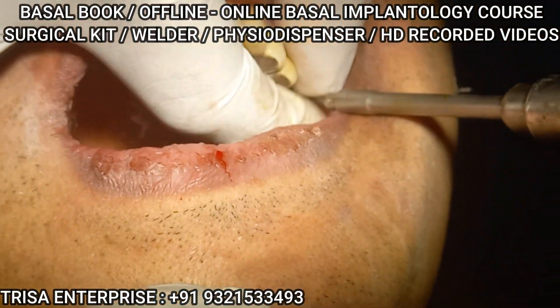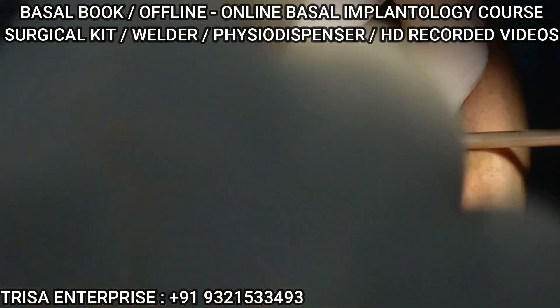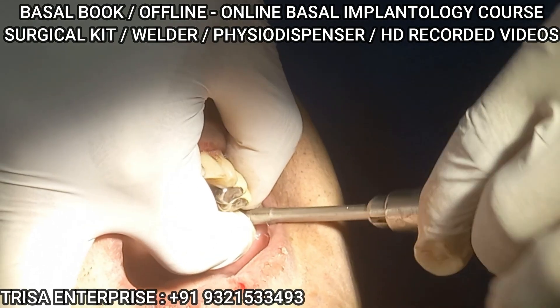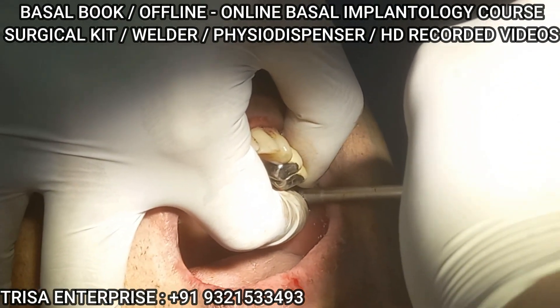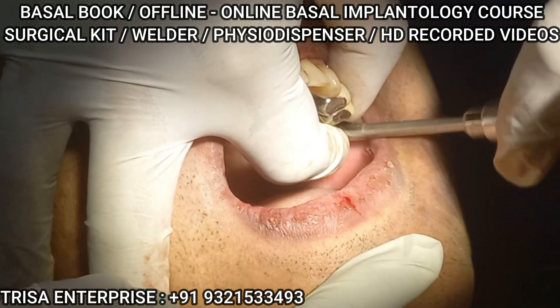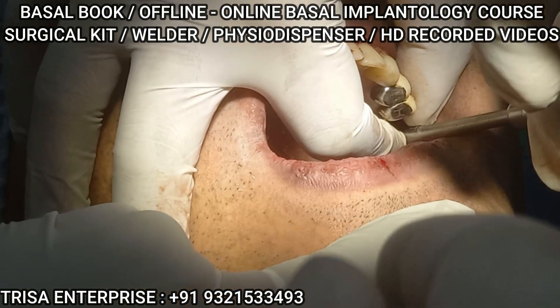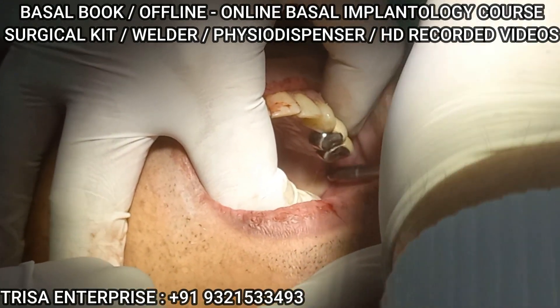You have to hold the shaft. Just do one second, half a turn. Okay, wait — now just one second. Just do a half-turn shake again. Getting torque — a little bit. Let me check. Now we are losing torque, but we continue because we are in the sinus. Got it — good torque.